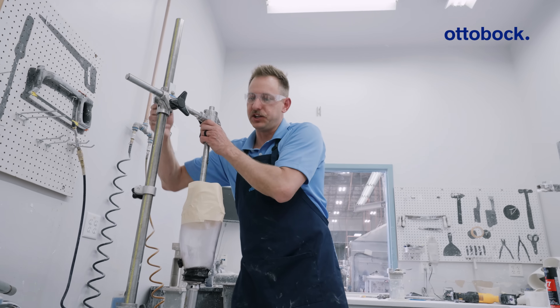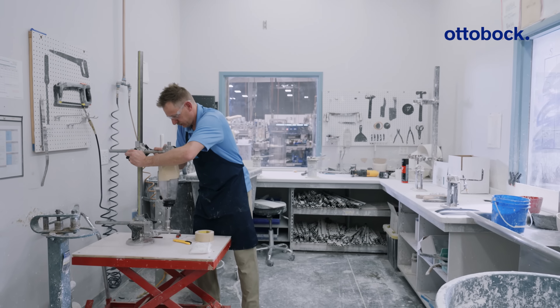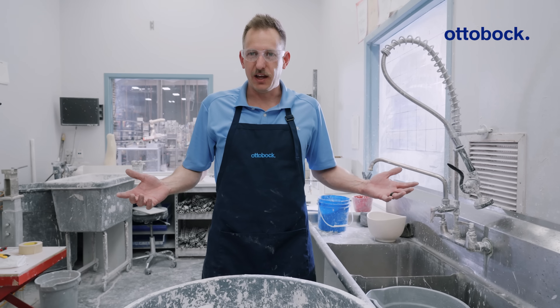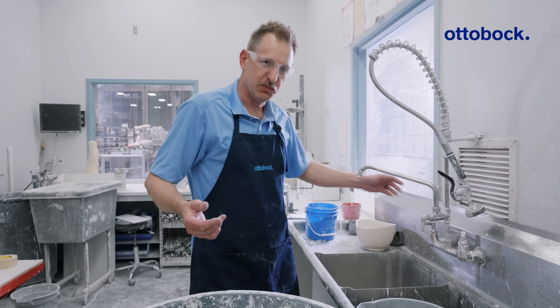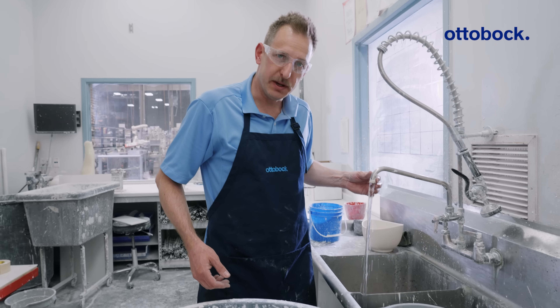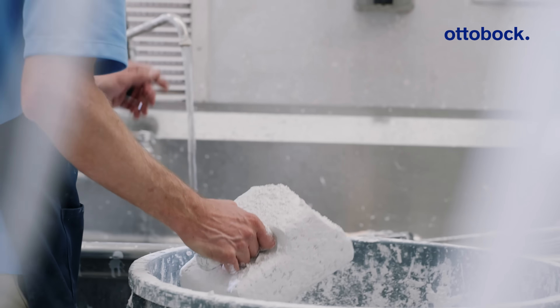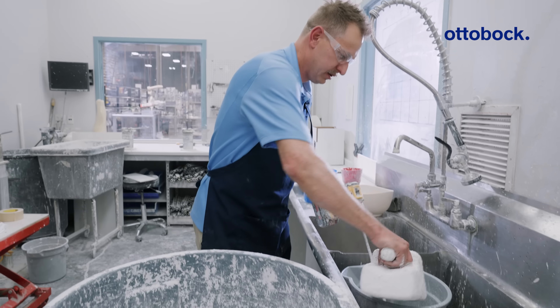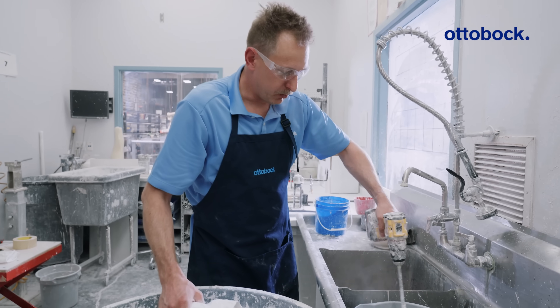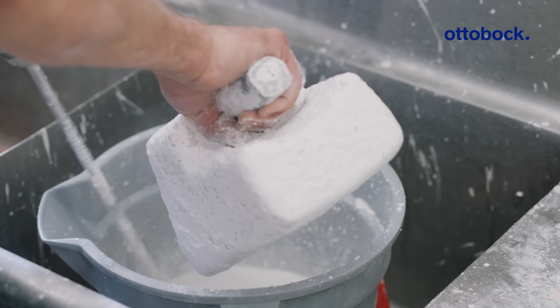Check the mandrel to make sure it's properly aligned. Another tip with mixing plaster: no one likes to sit around waiting on cold plaster to set, so use warm water — warm it up ahead of time. If you're in a very humid climate and it isn't setting up fast enough, you can also add regular table salt and that will set it off very quickly. Begin with turbulent water, mixing in your plaster. The consistency you're looking for is about like melted ice cream.